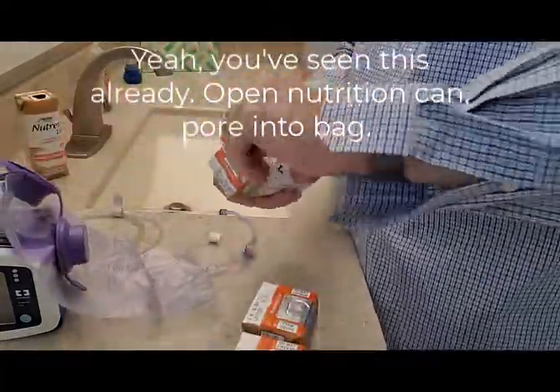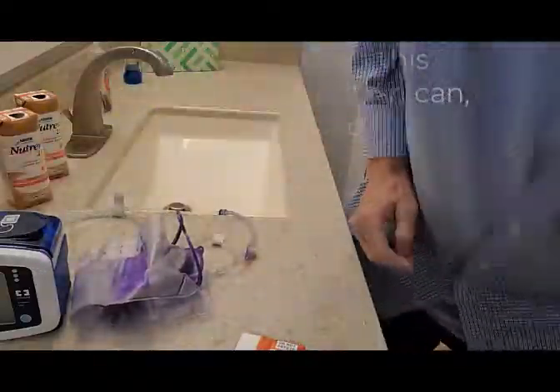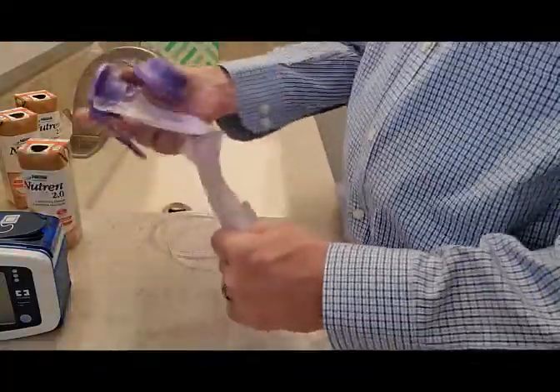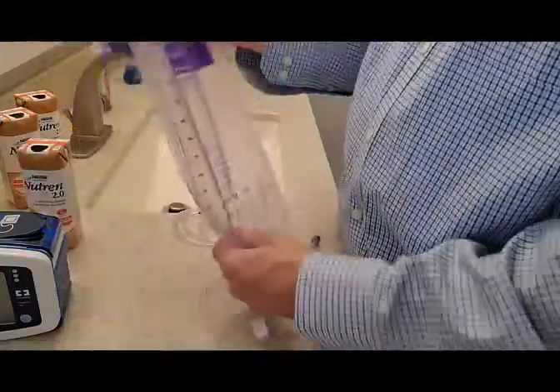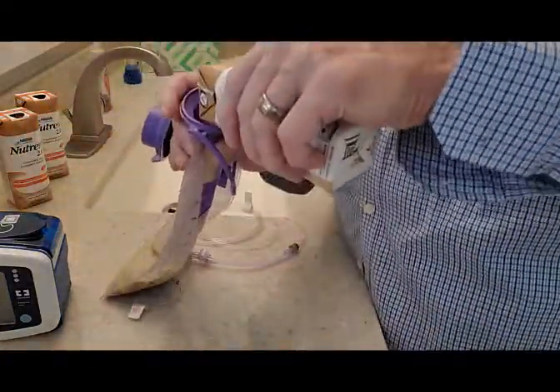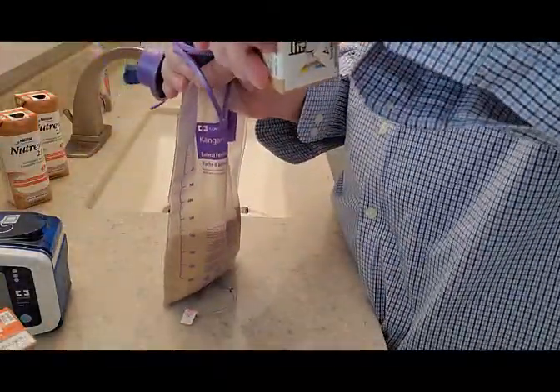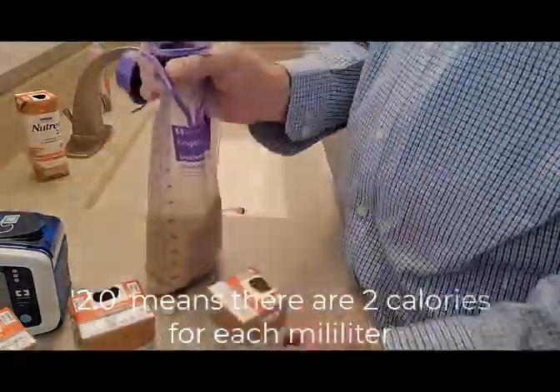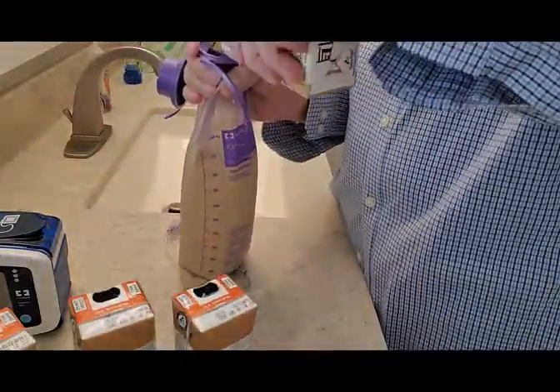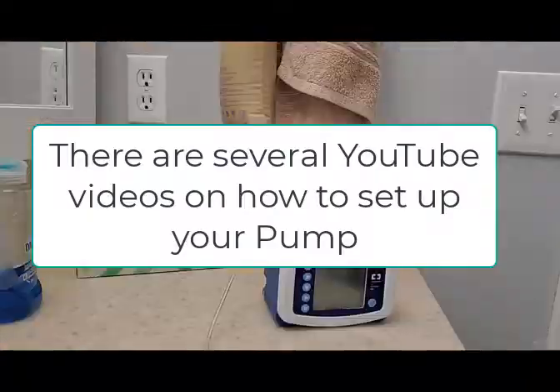All right, what you're seeing here is our friend loading the pump bag. It's exactly the same as if you were doing a gravity bag. The difference you're going to find, though, is there's a little bit more prep at the beginning to set up the pump. And as you can see, there's videos on how to set up your pump.